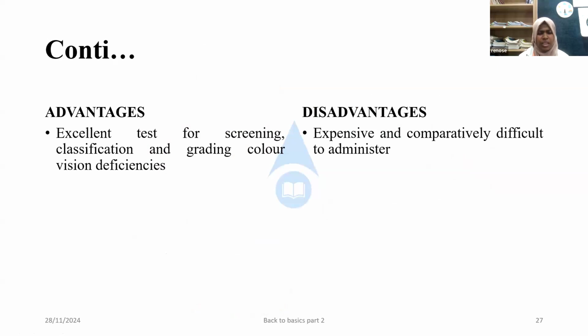Advantages: an excellent test for screening, classification, and grading of color vision deficiency. Disadvantages: expensive and comparatively difficult to administer.